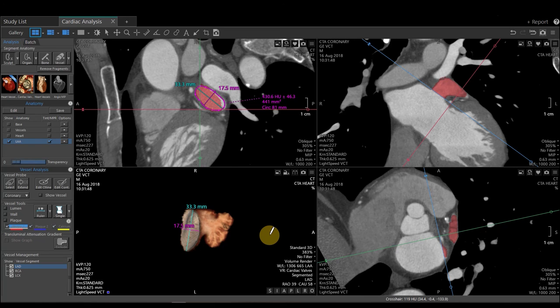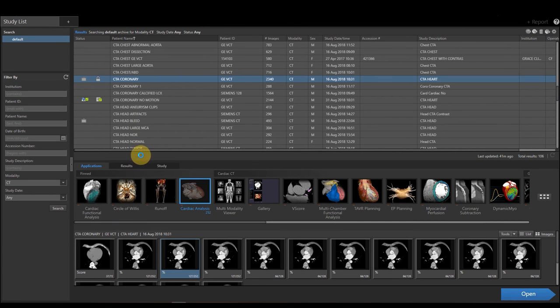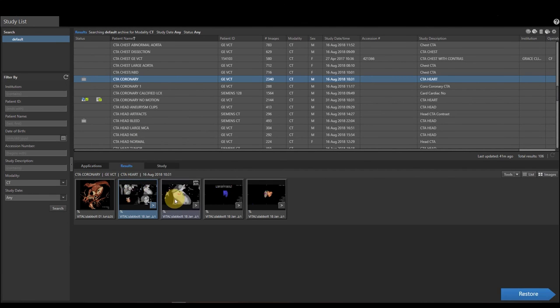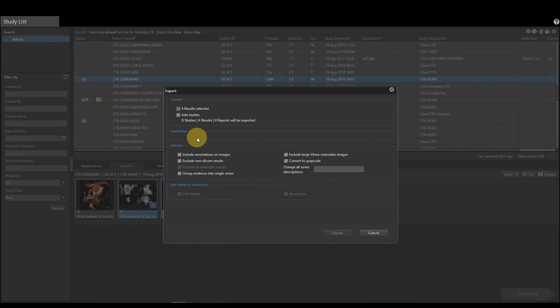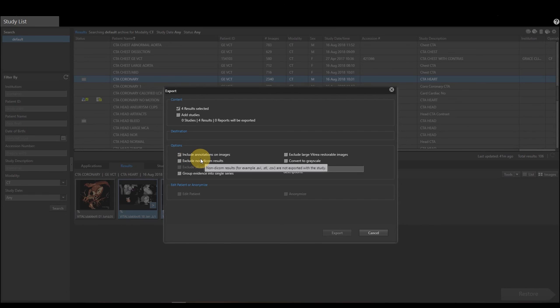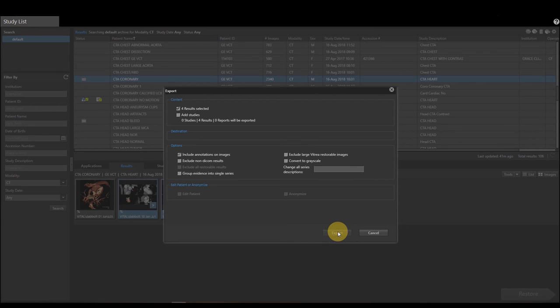Now that I've created my measurements and gotten my volume, I'm going to close out of the application. I'm going to go to the results section, select all the pictures I have created, right click, and export. You will have a predetermined destination already selected for your PACS. If I had any additional annotations, I'm going to select the include annotations on images option, and then I'm going to select Export. And that is a demonstration of the left atrial appendage utilizing the cardiac analysis application in Vitria version 7.